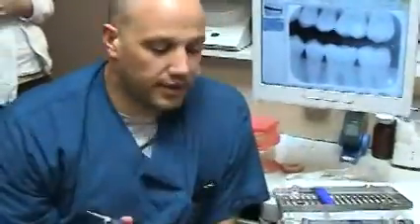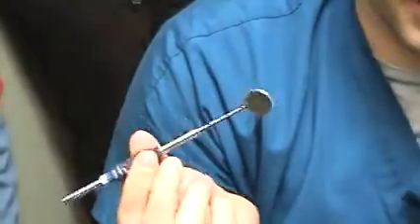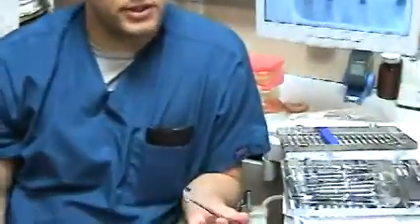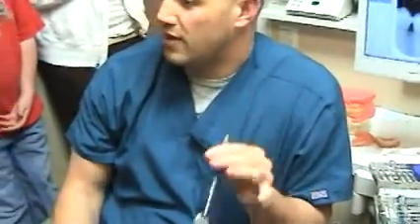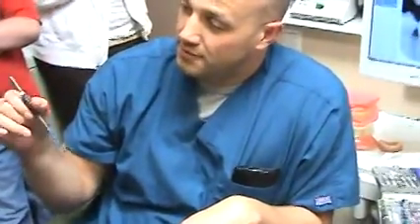Okay. And then this is a very handy piece of instrument. What do you think it is? It's a mirror. So that I don't have to sit there and break my neck when I'm all the way hunched over trying to look at the different parts of your mouth. Yeah, exactly. So everything I do in dentistry, I almost always have a mirror in my left hand. If I was left-handed, I'd probably use the other way.